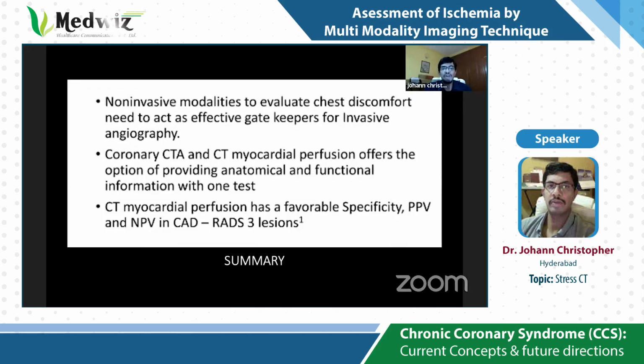In about 30 to 45 minutes, you've completed the test and the patient can go home, and the processing takes about 1 hour. So CT myocardial perfusion, according to me, has a favorable specificity. It's got a good positive predictive value and an excellent negative predictive value in CAD-RADS3 lesions or intermediate patients and intermediate lesions.